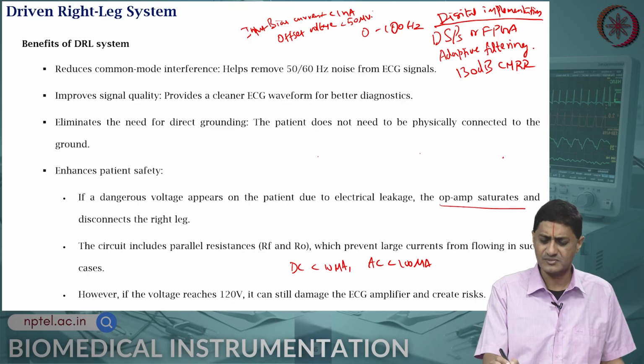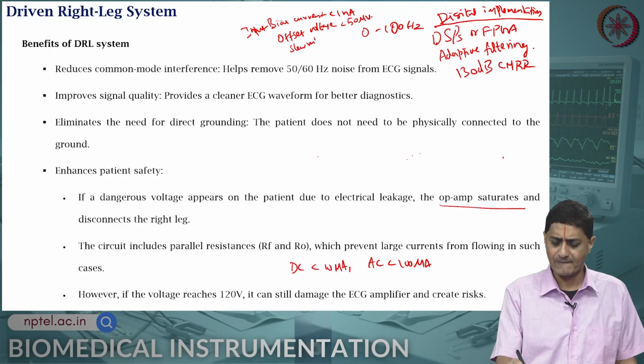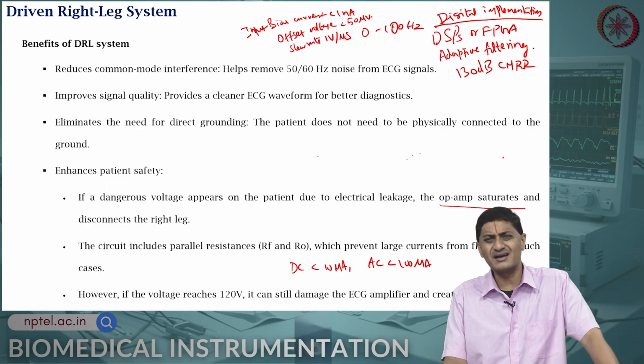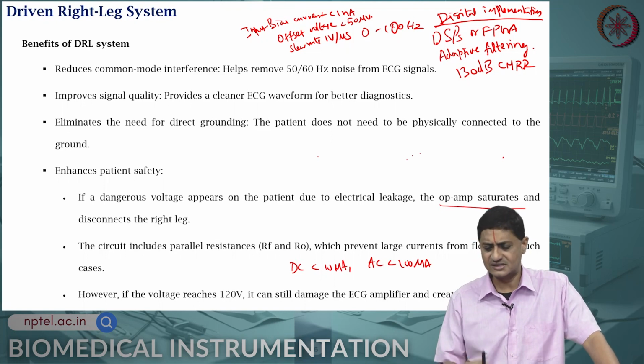I think so, but do check this. Slew rate of 1 volt per microsecond, and so on and so forth. These are the expected op amp characteristics. There are some op amps that are ready made and used for this purpose. You can check those. Many companies offer this kind of op amps that meet these criteria.